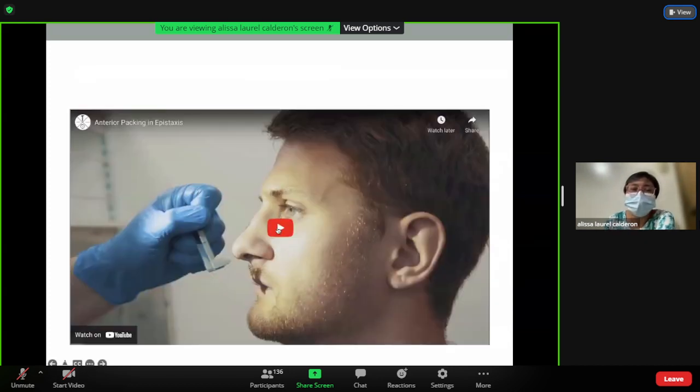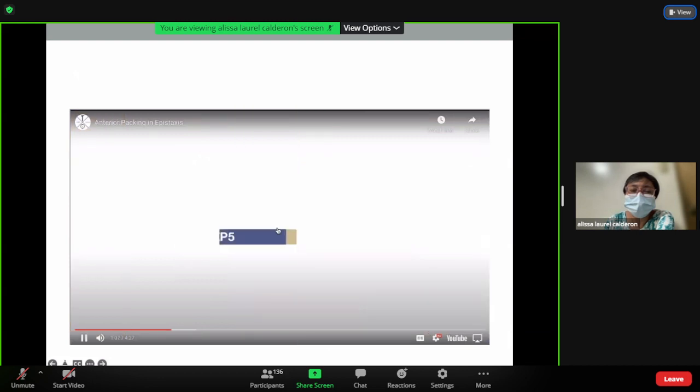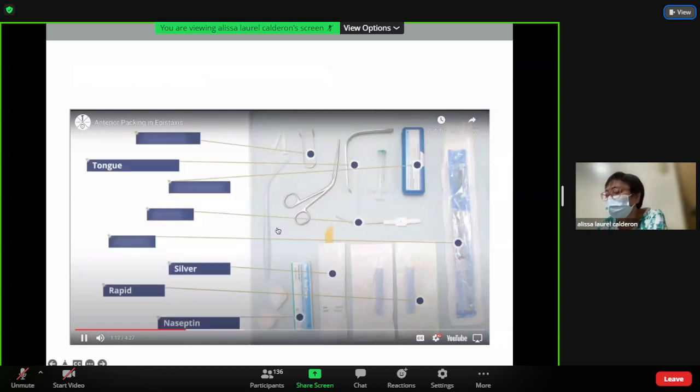So this is how to do your anterior packing. Step 5, anterior packing. Be prepared before you start. Protect yourself and gather all the equipment you will need so that it's within arm's reach. Shown here is a typical trolley for dealing with epistaxis.